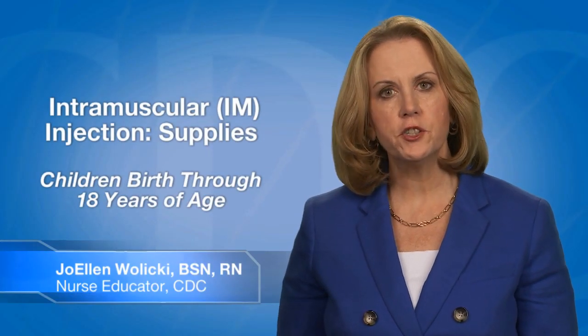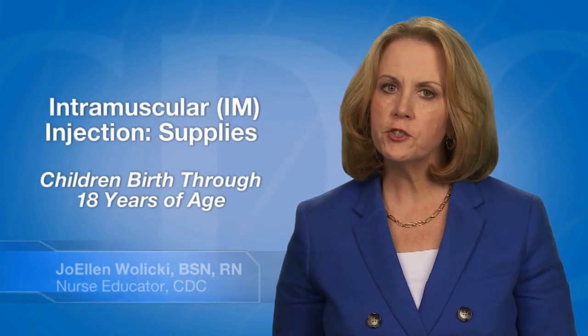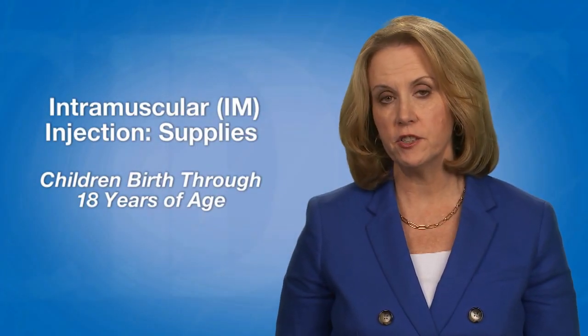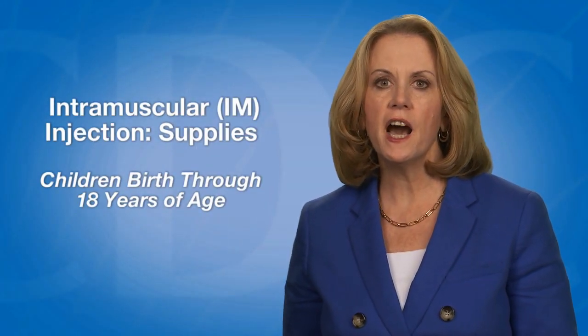In this video, I will describe how to select the equipment needed to prepare a vaccine for an intramuscular injection for children birth through 18 years of age. This route is abbreviated I-M.